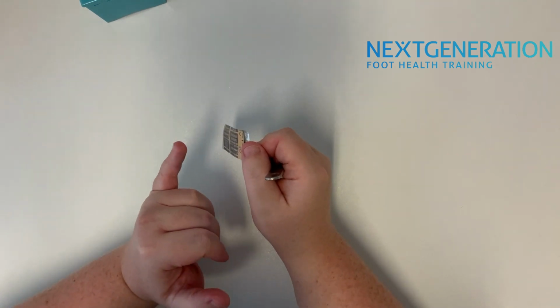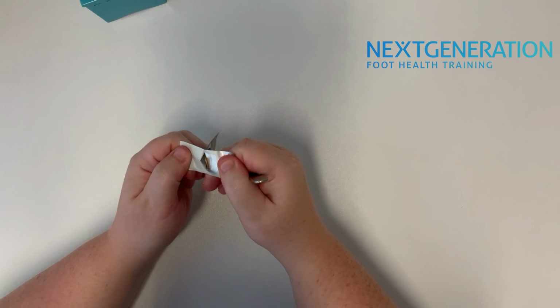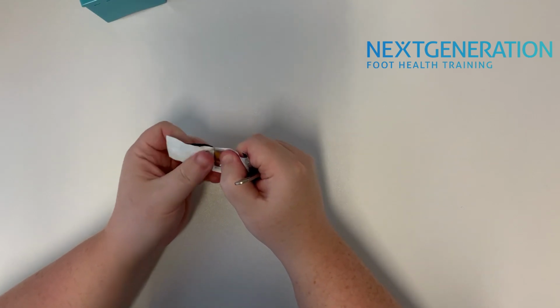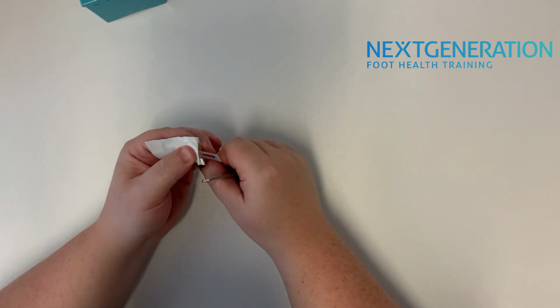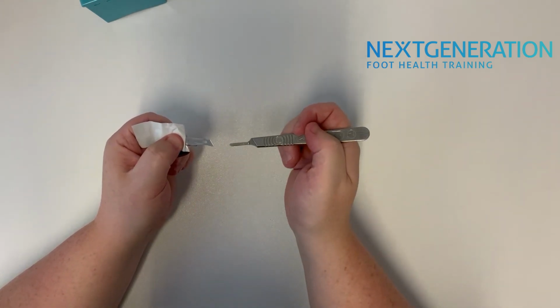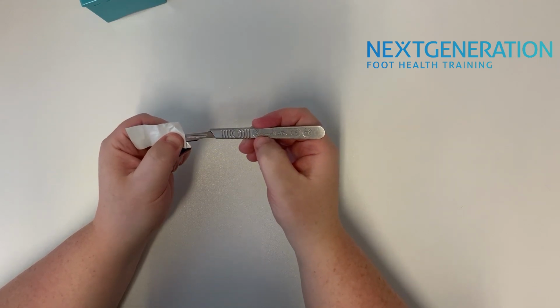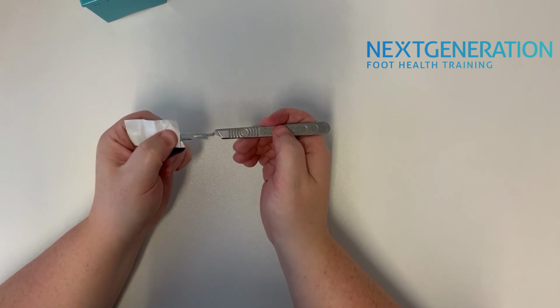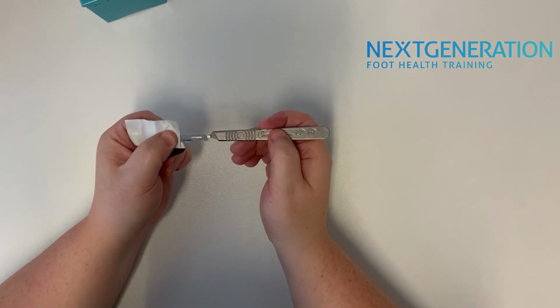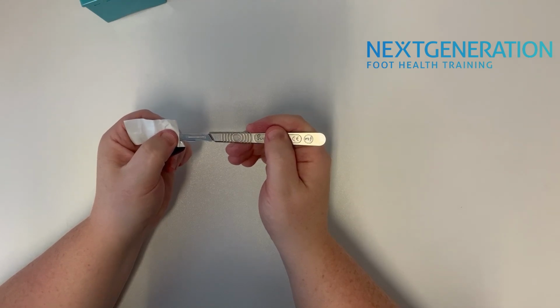So remember, right-handers, go to the left, silver to the right, unwrap the foil packaging, hold onto the blade at the bottom, get rid of all that wrapping front and back. So you need it Swann Morten side facing up the handle piece, because that angle there needs to match up with the blade. You're going underneath the big hole, bringing the handle piece level as you get to the narrow part of the blade, and the tip of that handle piece attaches. A little gentle encouragement, that is all.